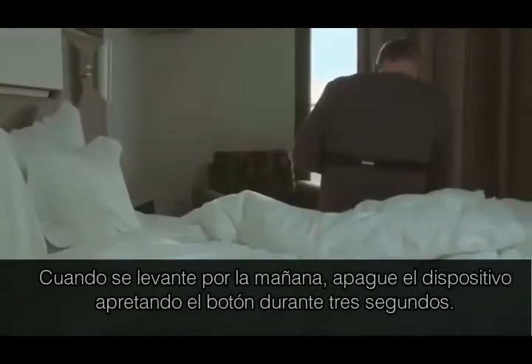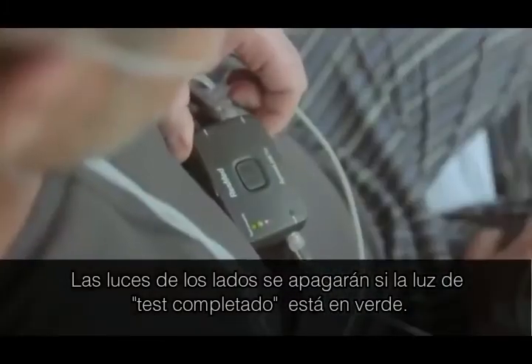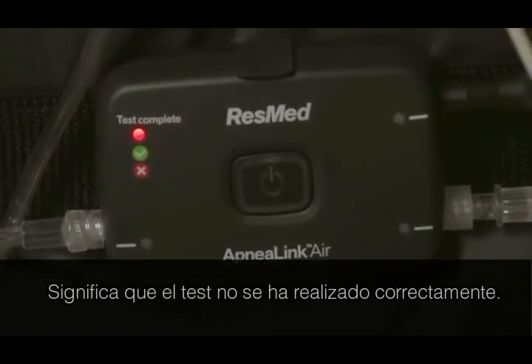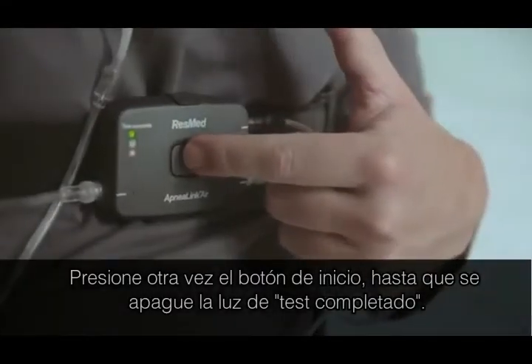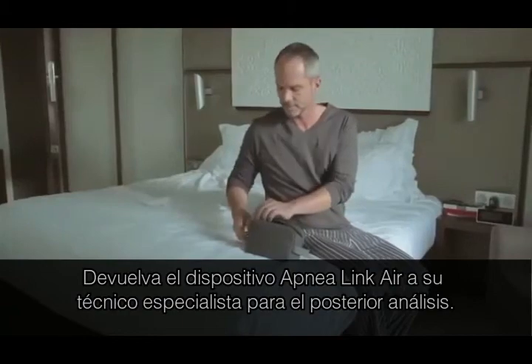When you wake in the morning, turn the recorder off by pressing the button for three seconds. The light will turn off. If the test complete light goes green, you have successfully completed your overnight study and can now return the device to your health care provider. If the test complete light is red, contact your health care provider as the test may not have been successful. Press the on-off button another time until the test complete light turns off and return the ApneaLink Air system to your clinician for the analysis.